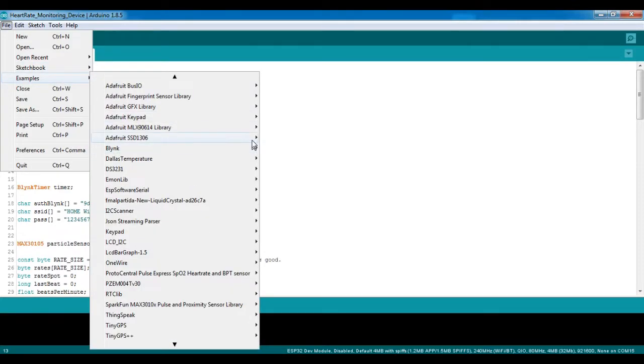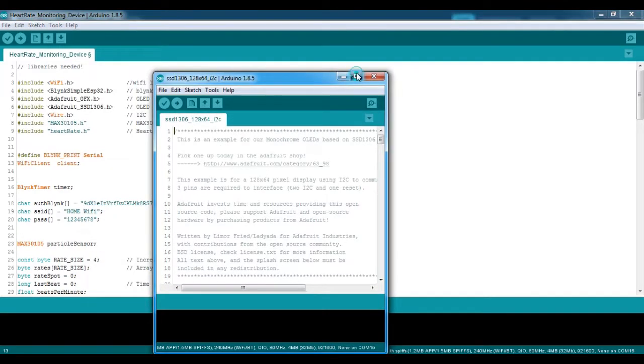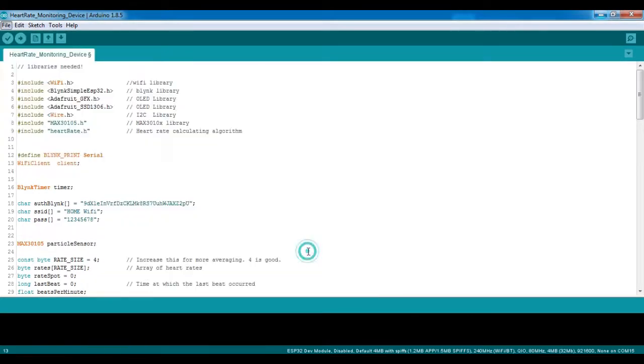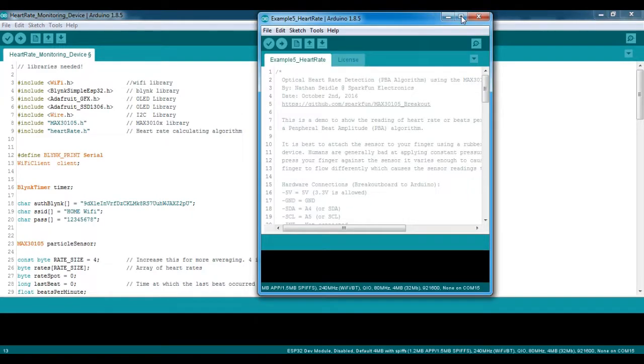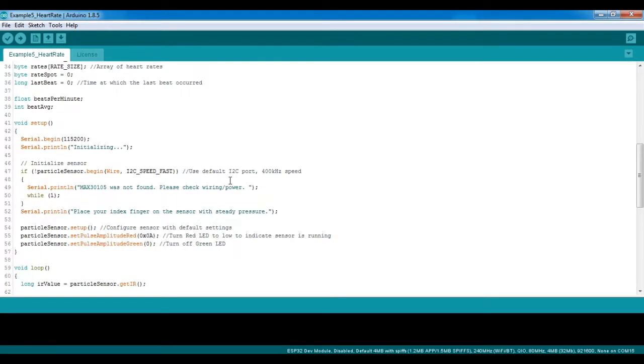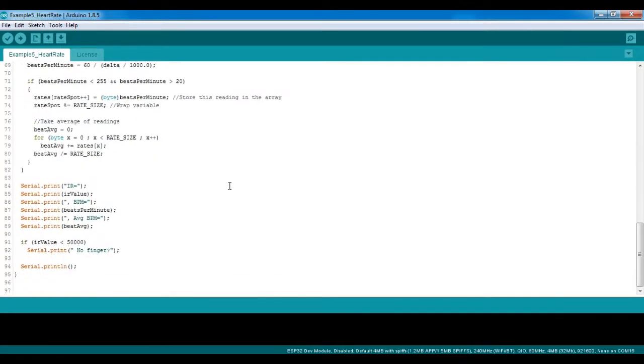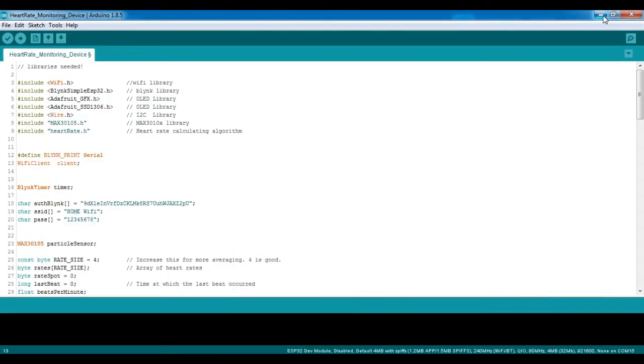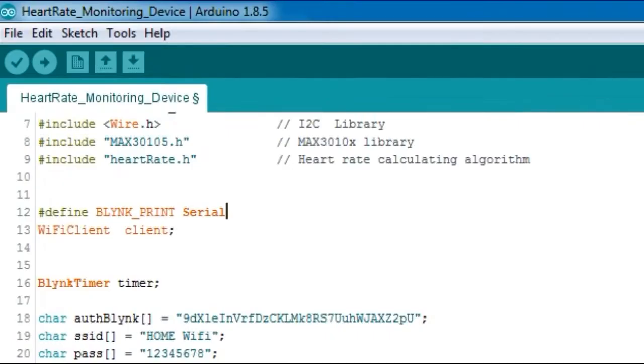It is easy to open the example code for the OLED display and the example code for the MAX30102 sensor. What was done in this code was to combine the previous two codes together and also added up my Blink setup.